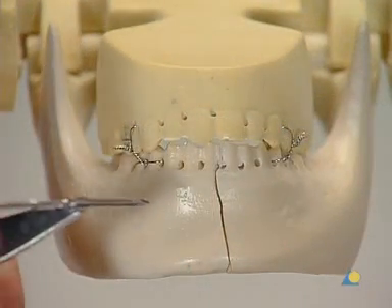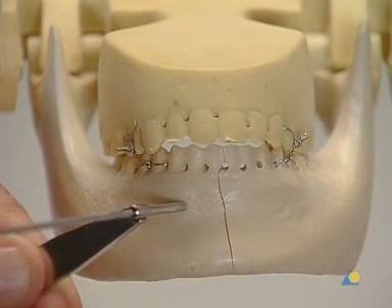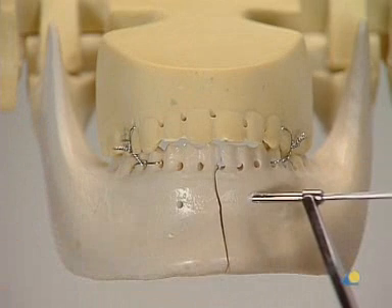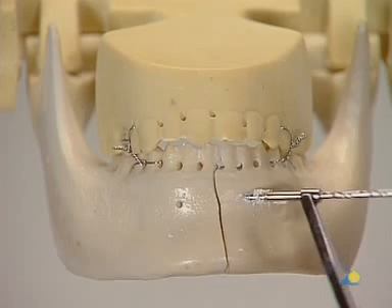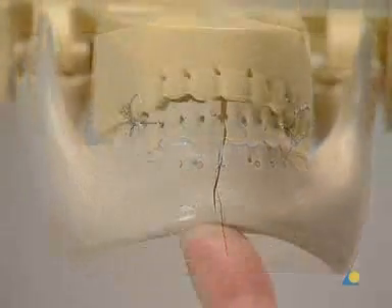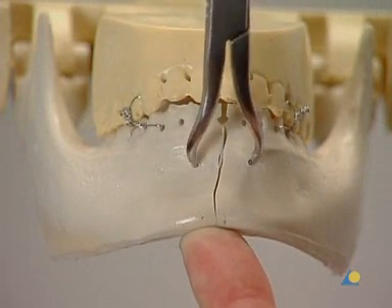For this model, it is necessary to pre-drill two monocortical holes at the superior border on either side of the fracture to help when placing the reduction forceps. In the clinical situation, care should be taken not to harm the dental roots. The mandible halves are manipulated until anatomic reduction is achieved.